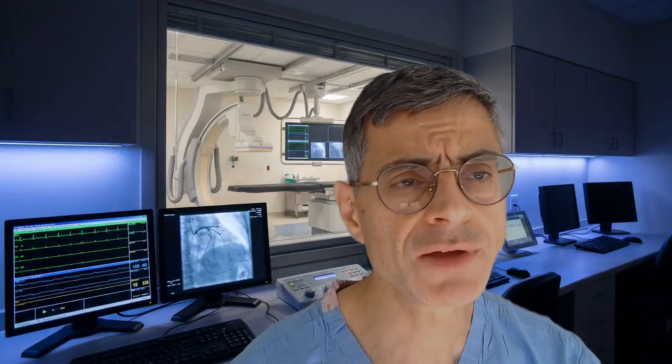Yes, Yader, and you're absolutely right. This was the first randomized trial of virtual PCI. It was done using the RACE system, and Kefei Du from China presented it. And it had very interesting results. It was used to plan PCI. And what was found is that patients who had the virtual planning were able to achieve much higher rates of a high FFR compared to patients who did not have the planning done.